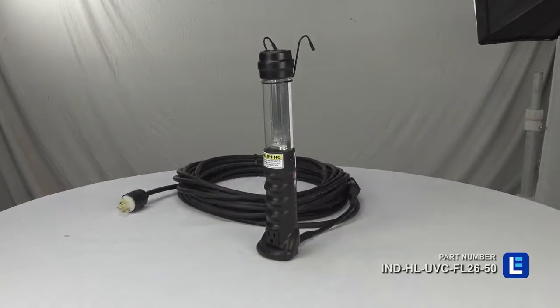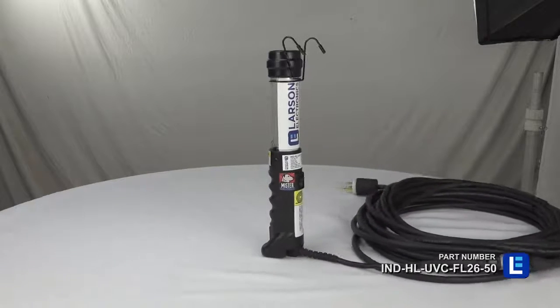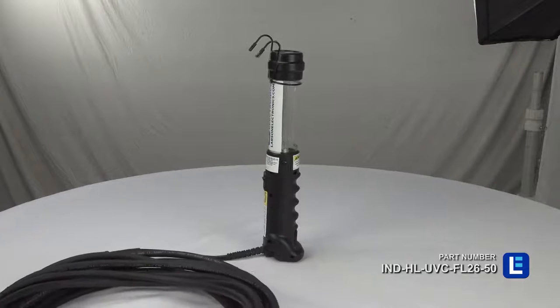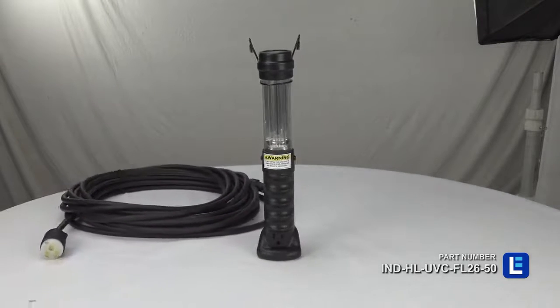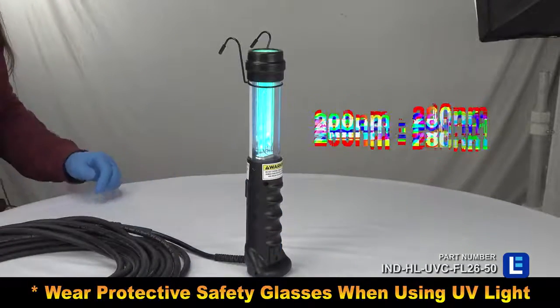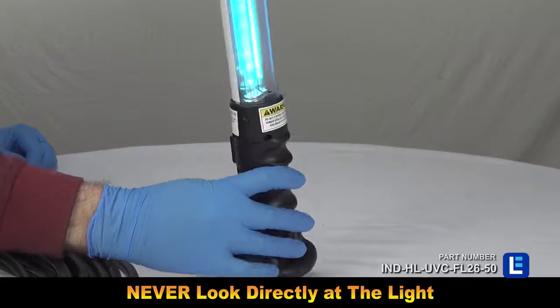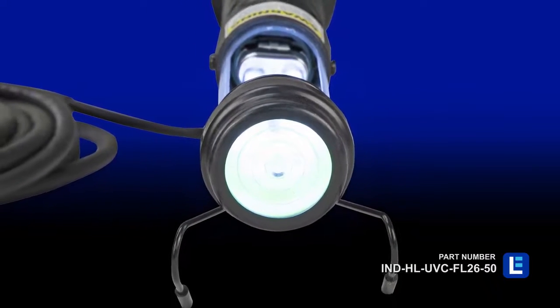The Larson Electronics IND-HL-UVC-FL-2650 is an industrial handheld UV disinfection light which can disinfect viruses and bacteria on surfaces including workstations, machines, tables, and more. This unit offers UVC output at a range of 200 to 280 nanometers and a 180-degree range of coverage, protected by molded bumper guards.